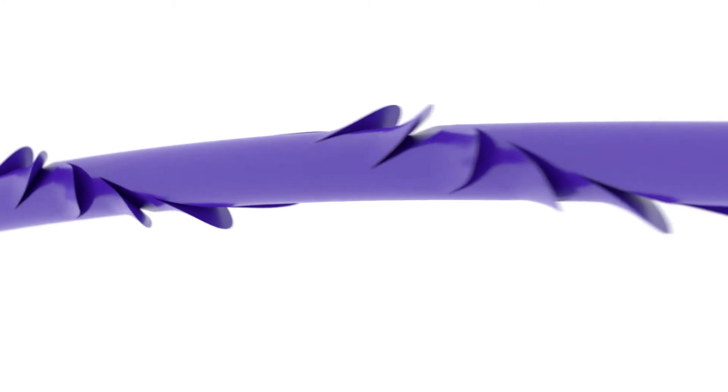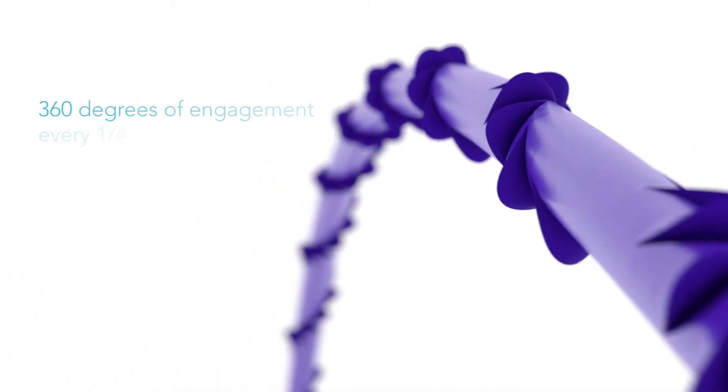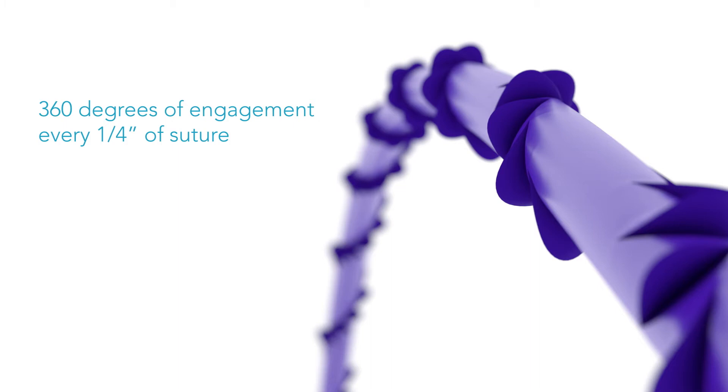With automated technology, Quill manufacturing starts with a traditional suture strand. Barbs are precisely carved in a helical pattern around the strand. For every inch of material, the spiral wraps around the suture five times, giving 360 degrees of engagement every quarter inch of suture.